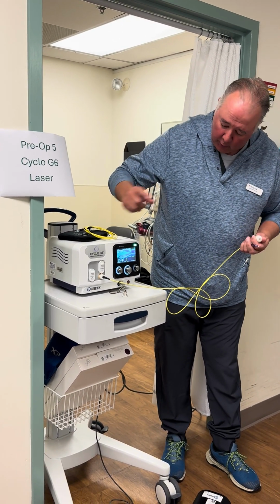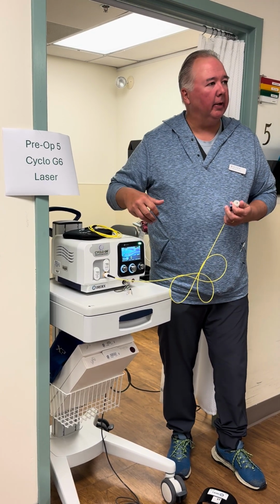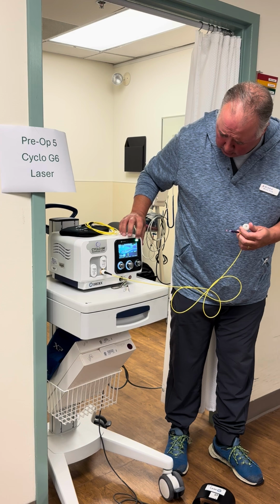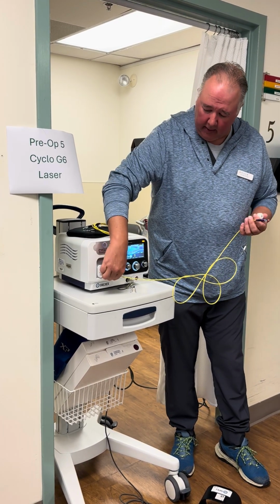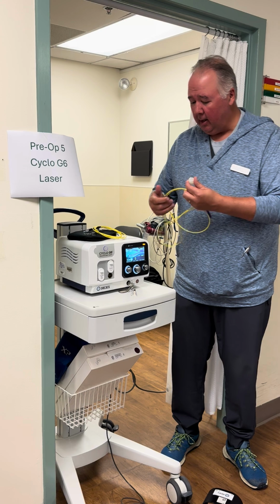Now they're going to have to do another quadrant, so you just hit this 0 and it's going to start the cycle again for the next quadrant, and so on and so forth. At the end, you'll just hit the green button to disarm the laser, and you can take the probe out. These are just normal disposables, nothing special about it.